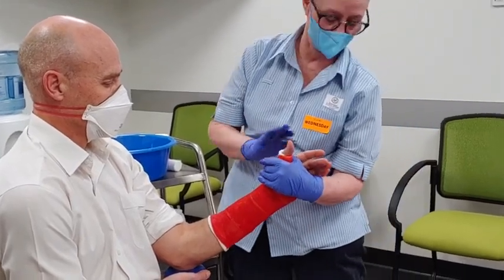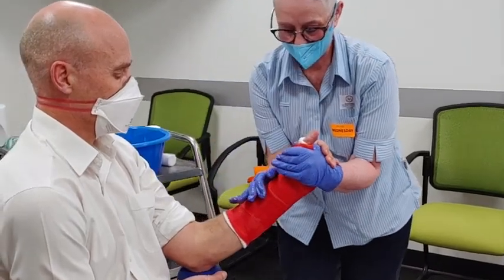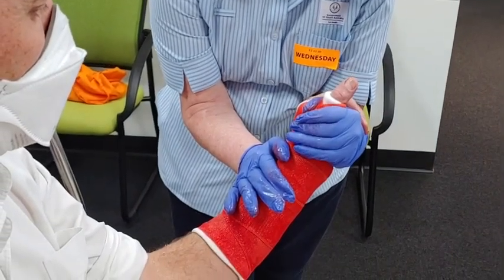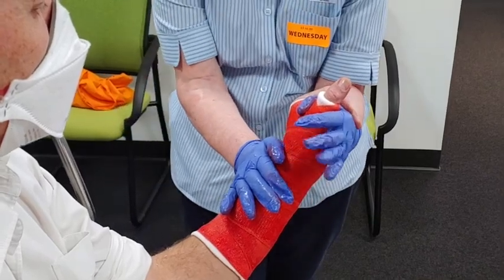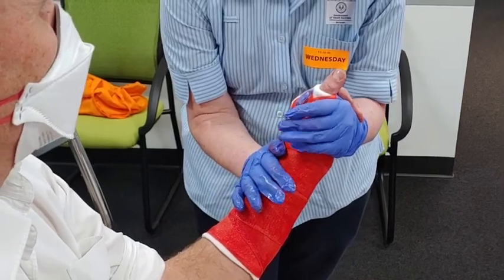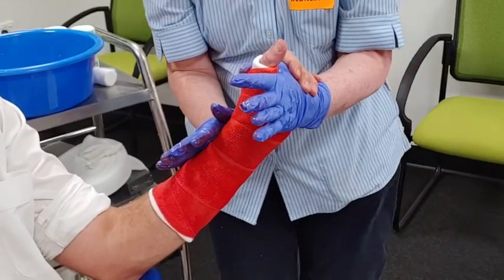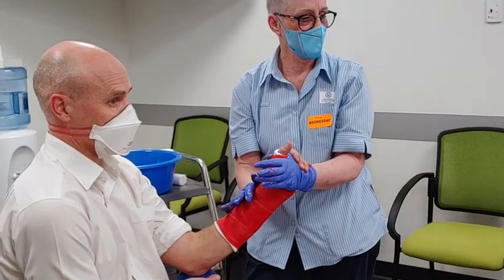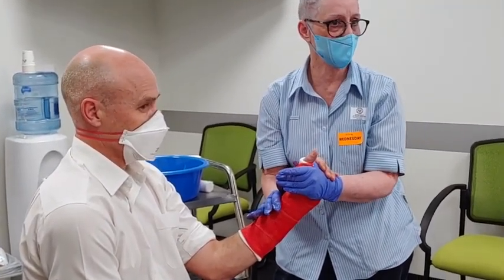Check your edges. Now we do the moulding — get the patient to grip your hand gently and mould around like so. Push from the back to get that wrist cocked back, and mould around the base of the thumb as well. Most of the pressure is with your palm — always the flats of your hands when casting, never your fingers. Fingers will leave indentations that cause an abrasion under the skin, and within 24 to 48 hours you've got an ulcerating wound.